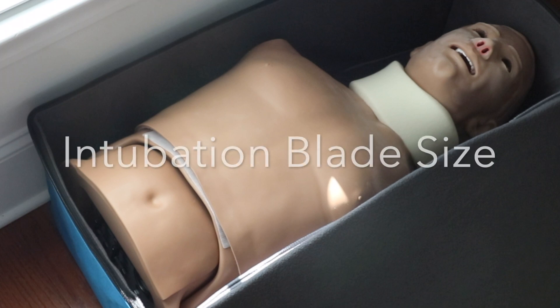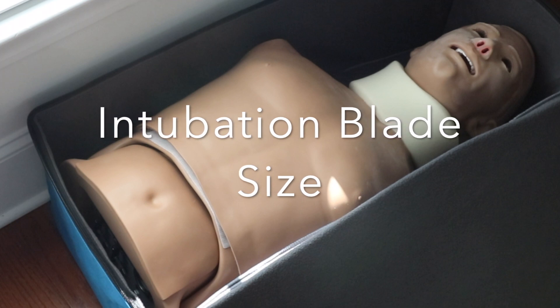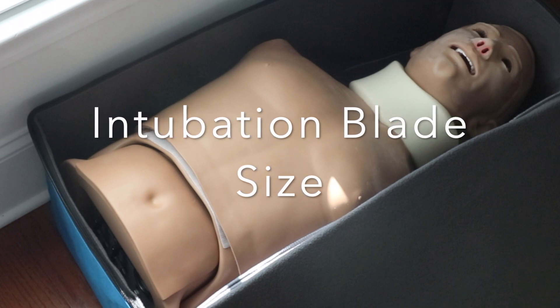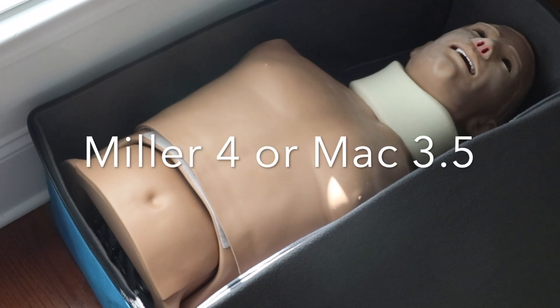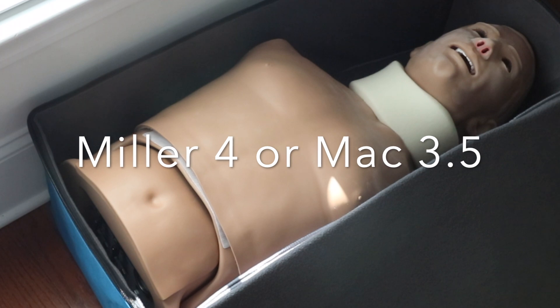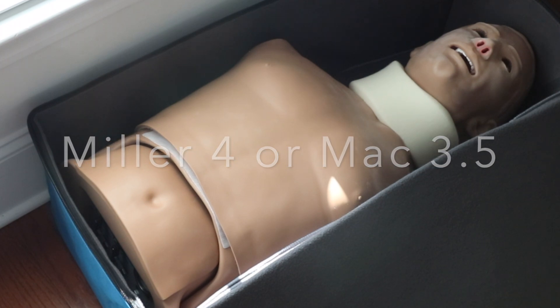Here are a couple numbers you need to remember. First, the intubation blade size — it should never be any bigger than a number four Miller or a three-and-a-half Mac. That's actually a pretty decent-sized blade, to be honest.